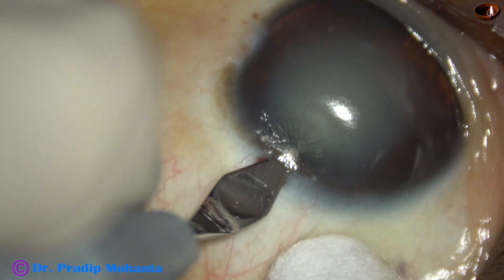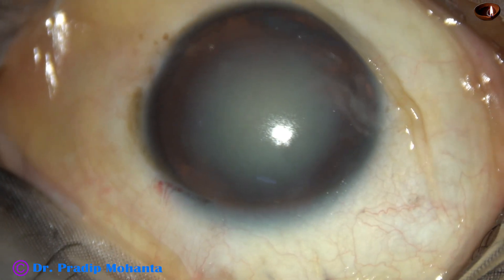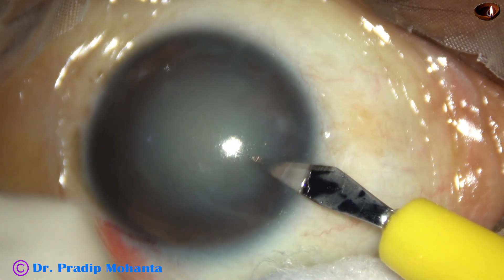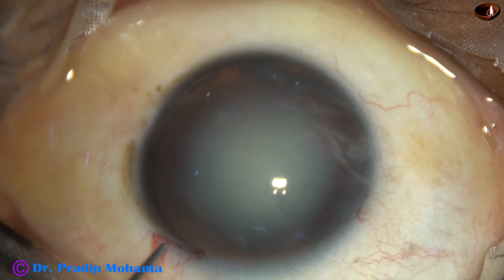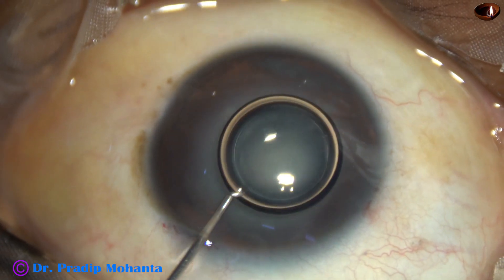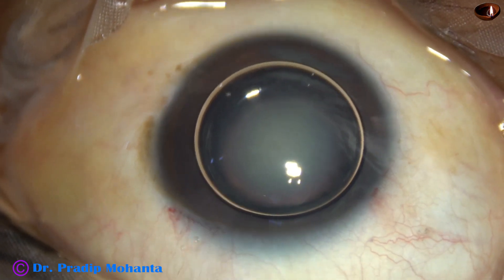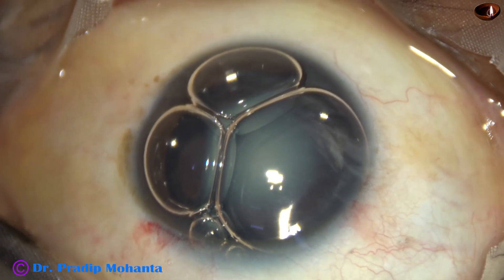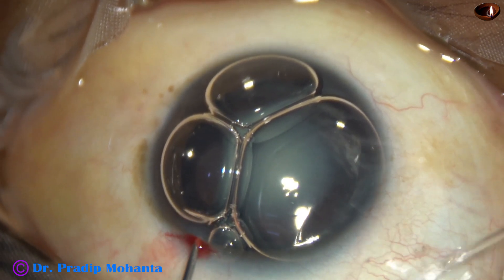Because if I make the main incision over that area, the irrigation pressure will cause vitreous hydration and the vitreous will tend to prolapse into the anterior chamber. So, with this thought in mind, I made the main incision at 2 o'clock. And now, a side port was made on the right side in that area.